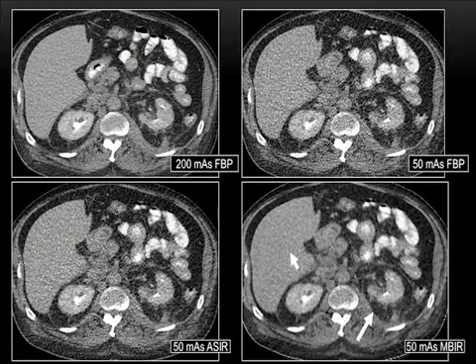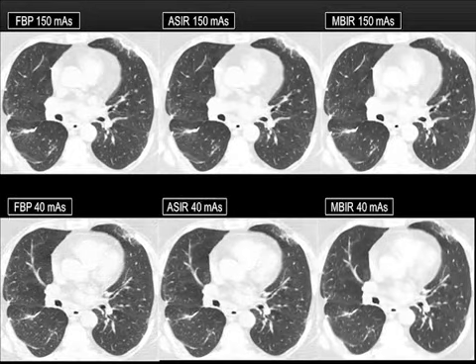Here's a slide again to show the effect of MBIR. This is recon with 200 mAs, filtered back projection. This is a low dose image. Recon with ASiR, noise probably the same, and with MBIR, noise going down. Now, in this liver parenchyma, we see these tiny pixel holes, which is also seen with this noise, but it's just a new look of the liver, which makes a GI radiologist not so comfortable saying that, I don't know whether this is a different kind of pathology. And also, if you look at this renal fascia over here, it's not as sharp as it should be. So that decreases the confidence of a reading radiologist.